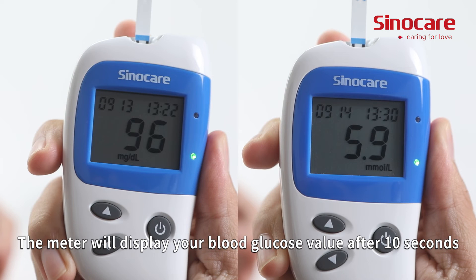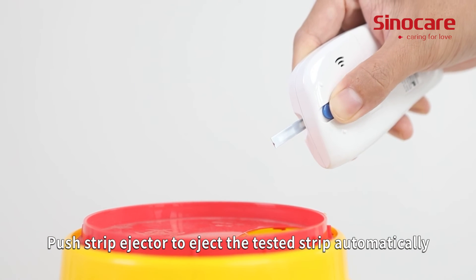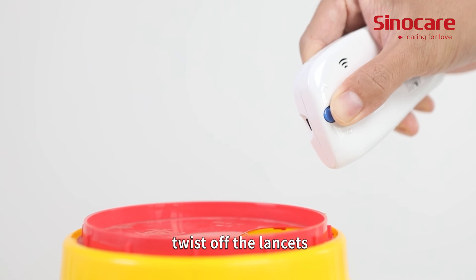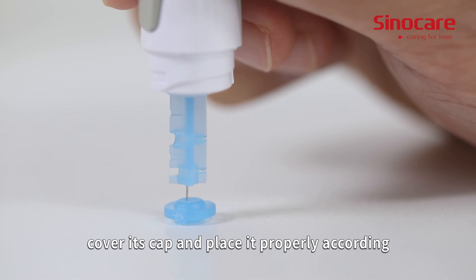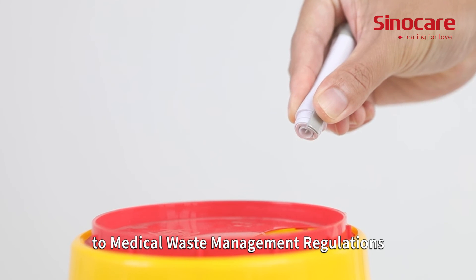The meter will display your blood glucose value after 10 seconds. Push the strip ejector to eject the tested strip automatically. Twist off the lancet, cover its cap, and dispose of it properly according to medical waste management regulations.